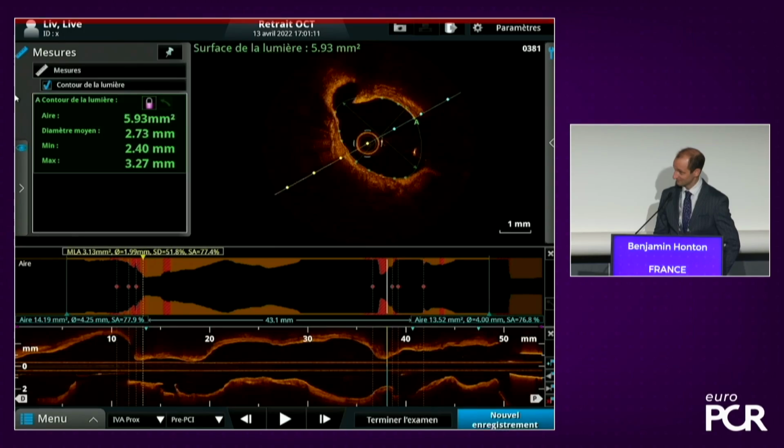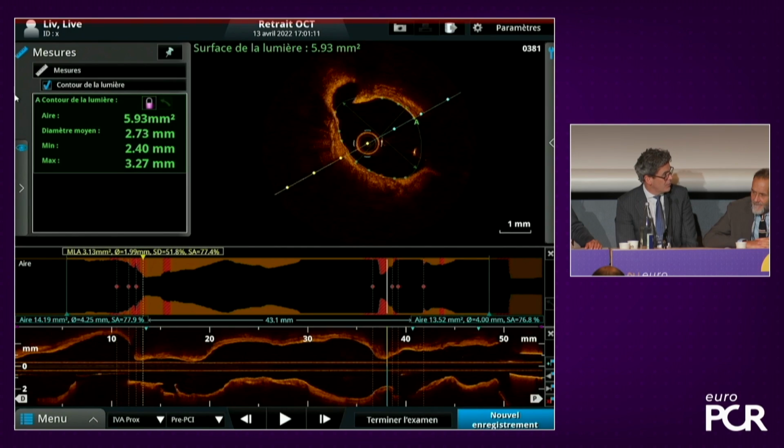I think you have to choose a tool here that allows you to do very exact focal modification of the areas of concentric calcification, and then also total lesion modification, because there's calcium along this whole vessel.